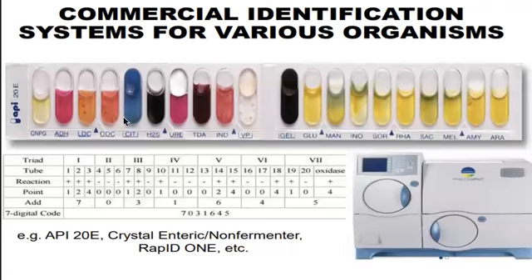Tapos yung tatlong set na naman, negative lahat, edi 0, 0, 0. O, di 0 yung kanyang total. And so on, no? And then, so meron ka ng code, 7031645. O, pagkatapos nun, i-feed mo yan dun sa machine. Ang galing, di ba? So, meron ka ng organism. Meron tayong mga ganyan. Ngayon, na-upgrade na, meron tayong Vitek. Di ba? So, mas pas-pas.